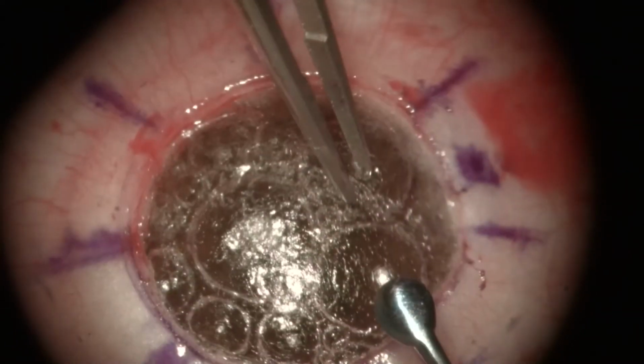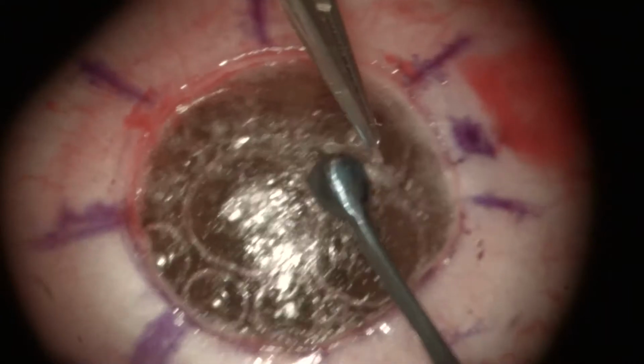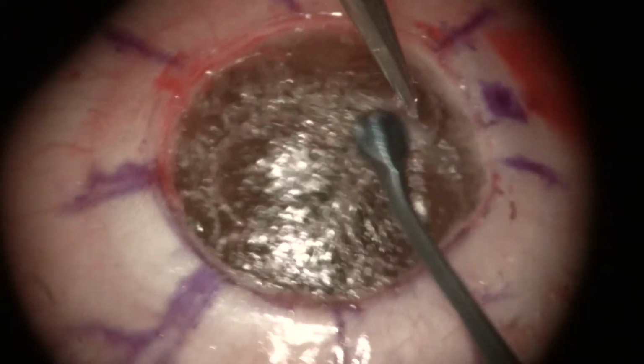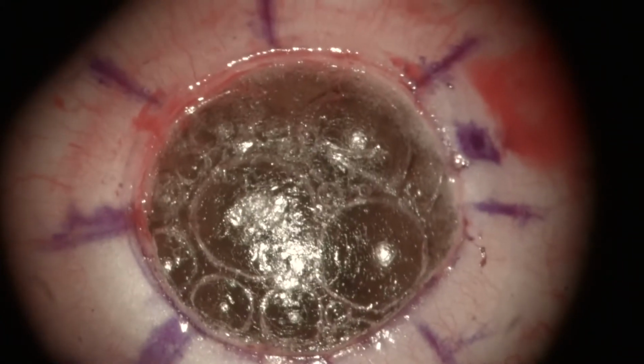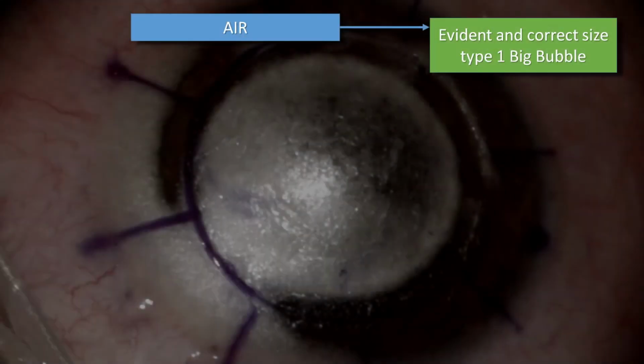This technique has the steepest learning curve with a high rate of perforation, but we strongly recommend trying it instead of converting into a PK. The following flowchart shows our DALK decision-making process. The chart exemplifies the different situations that we can encounter and how to solve them.